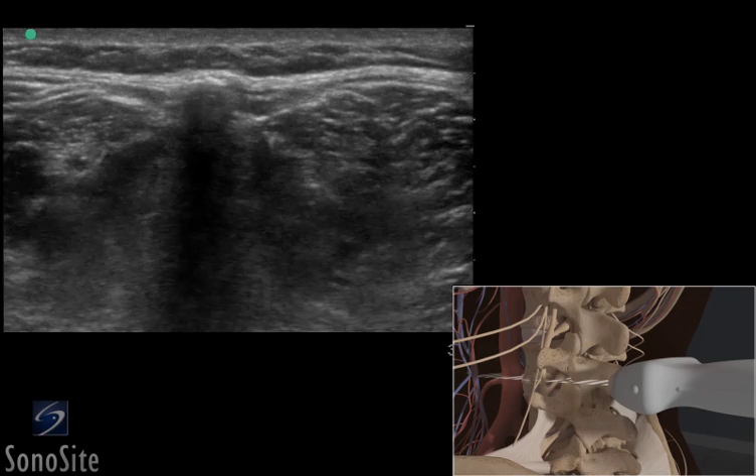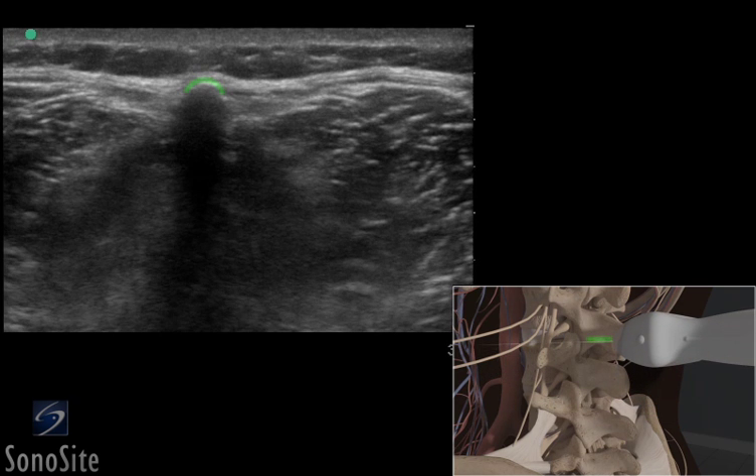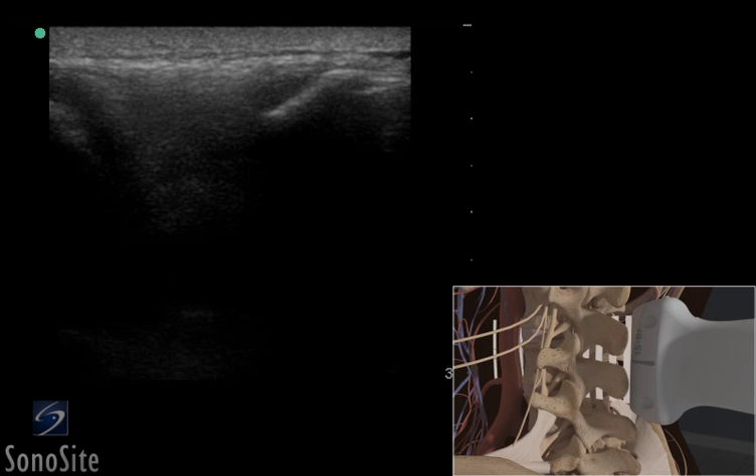The transducer is slowly moved superiorly until the next spinous process is identified. The transducer is then rotated 90 degrees with the orientation marker directed toward the patient's head.